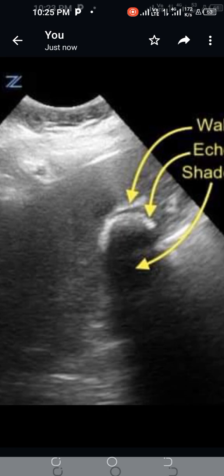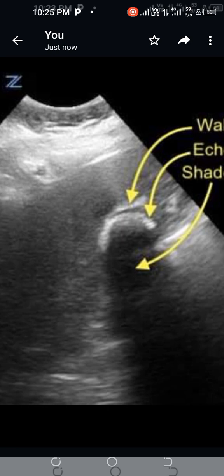In this labeled picture of the gallbladder, the outermost hyper-echogenic layer is the wall of the gallbladder, indicated by the curved arrow. In between, there is a hypoechoic space which represents a small amount of bile. Below this, there is another curvilinear hyper-echogenic layer, which is the second component of the Wall Echo Shadow sign.